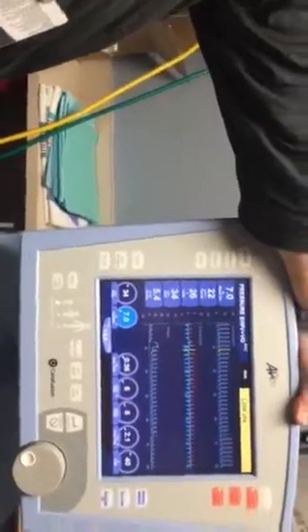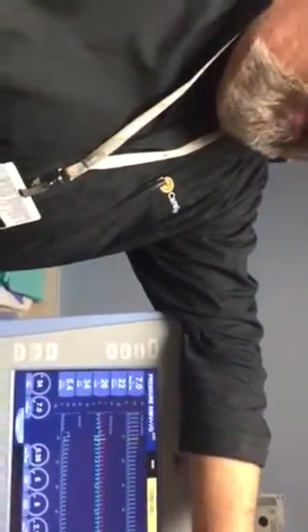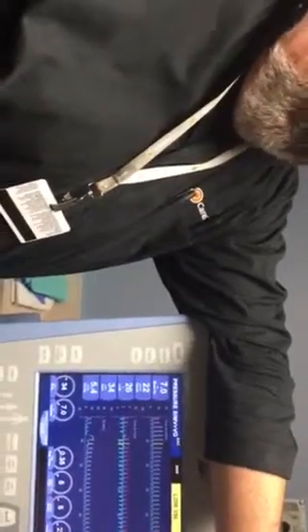So when they order it, this is what the docs are going to do. They're going to say, put this baby on volume guarantee with a target of 7 cc's. This baby's 1.5 kilos, so I'm going to target 7 cc's tidal volume. You're going to put them on volume guarantee with a target of 7 cc's tidal volume, and then keep an eye on what my PIPs are.